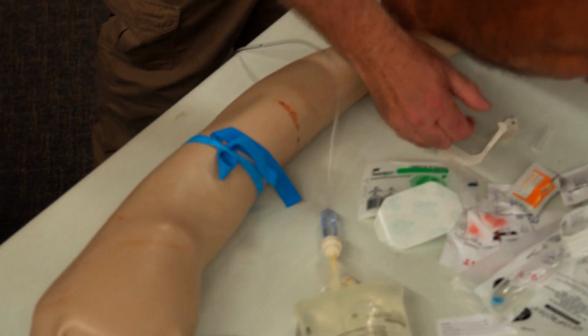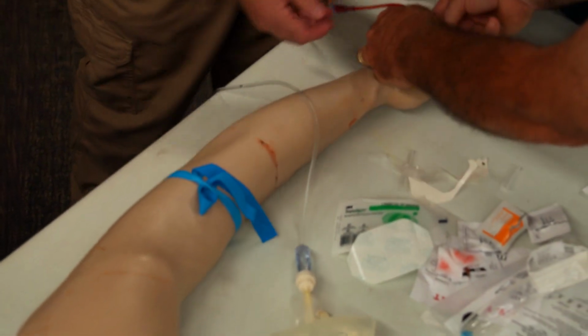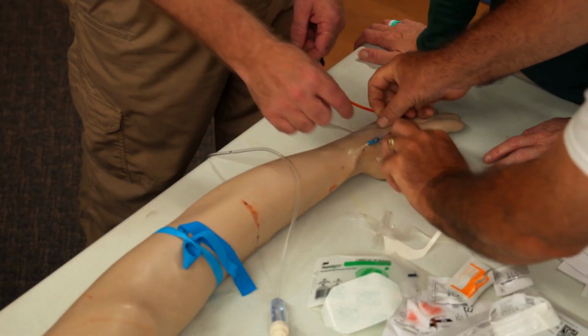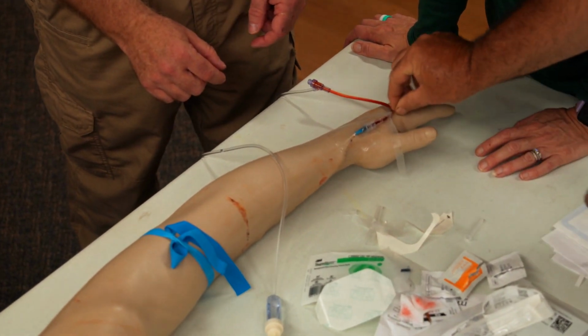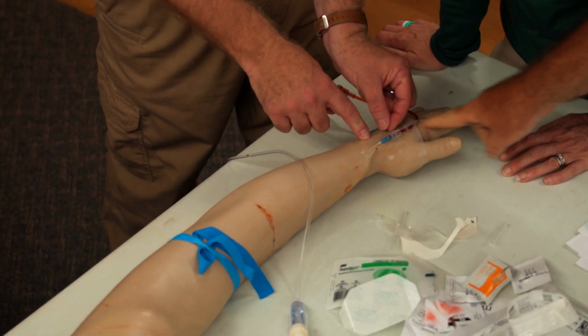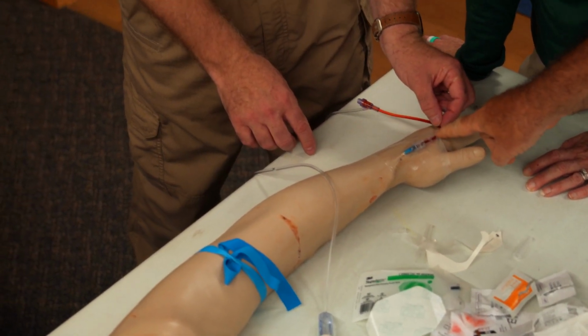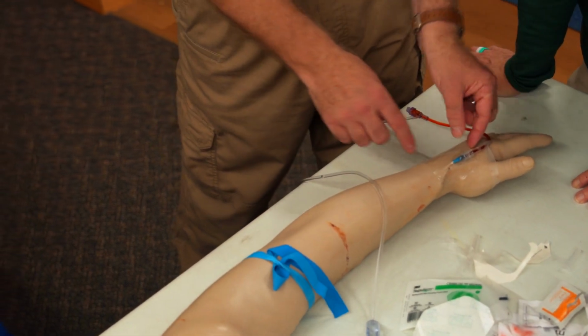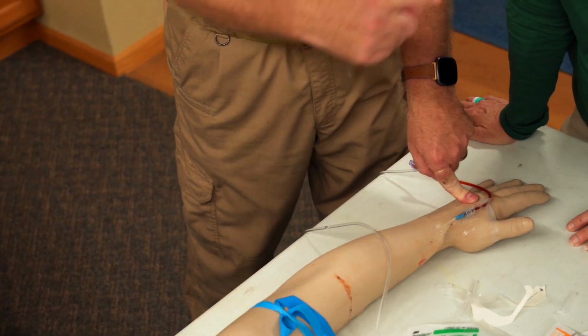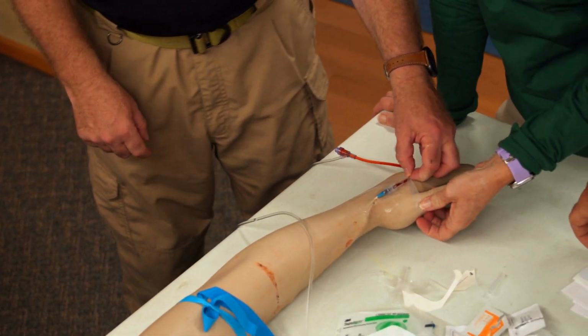They'll do around it. Yep. So that when they tape it down, this doesn't slide at all. That's another way of doing it. And so I do the same thing. Otherwise, you just have surface on the top. So you could do this too, because I do that except when I don't have this. But this is not bad. That's a really, really good idea because now you've got grip.